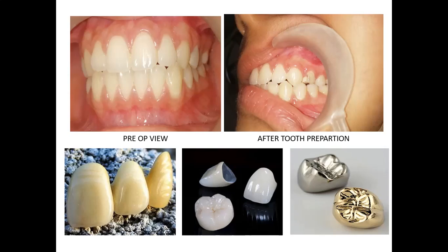Now, our concern is about the making of these prostheses. There are different methods for making such types of prostheses. Usually we cast these prostheses, or else we can go for CAD/CAM procedures for the fabrication of such sorts of prostheses.